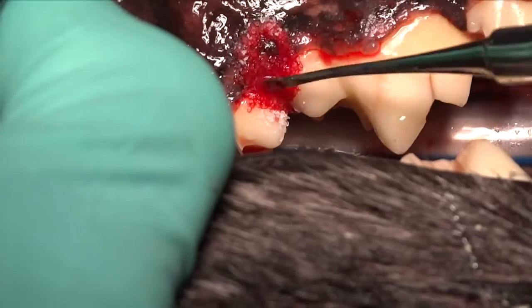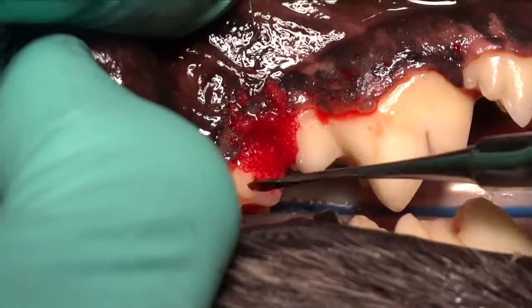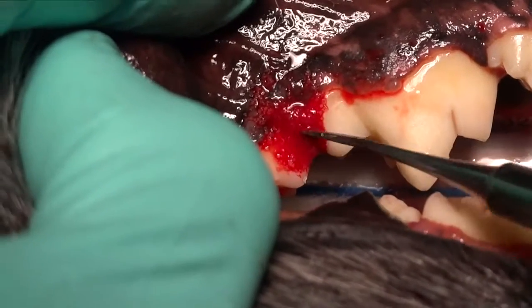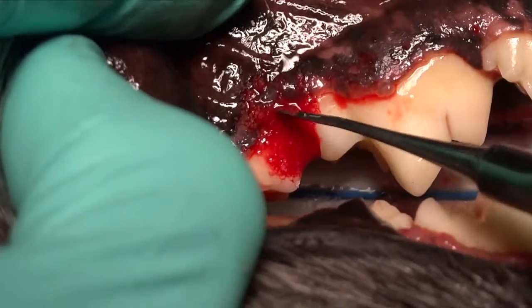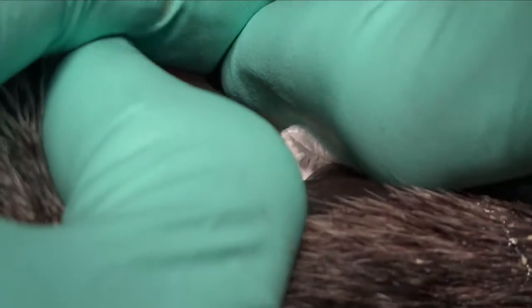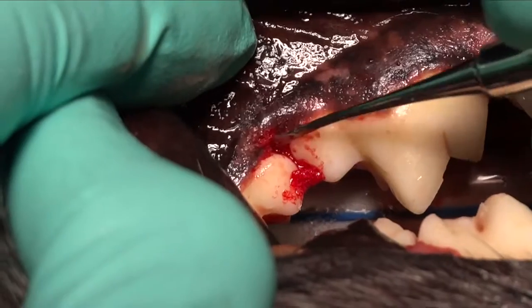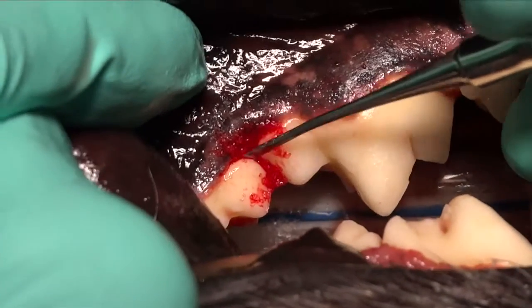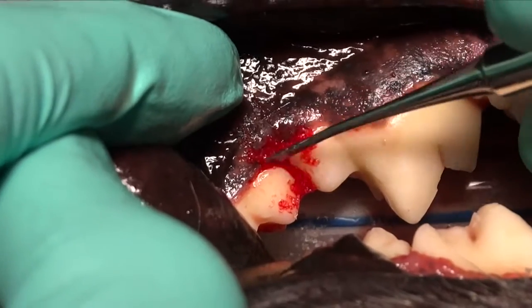We're placing Consil, which is a bioactive silicate glass — an osteoconductive bone graft — that we use to maintain the height of the bone where it exists now in the normal area adjacent to that defect. We want to try to grow that bone back up to that normal area, and we can very predictably do that using these techniques.